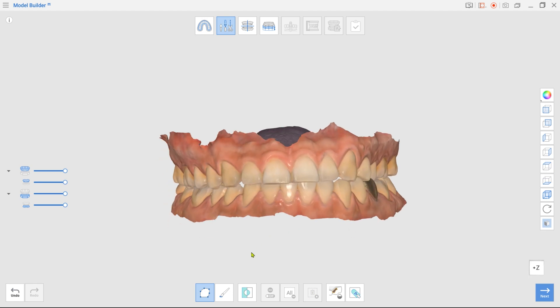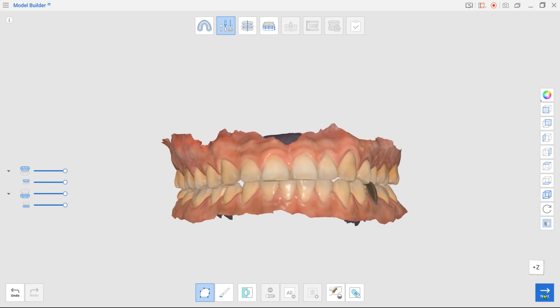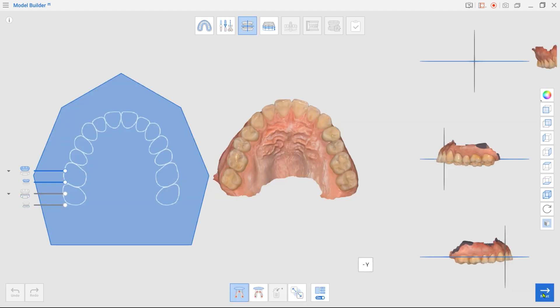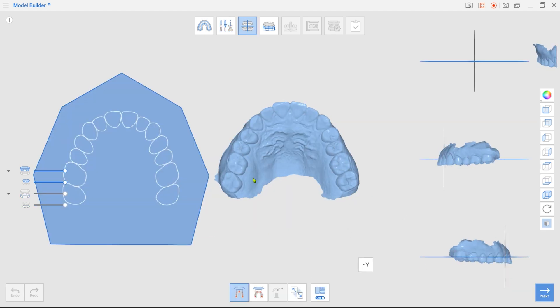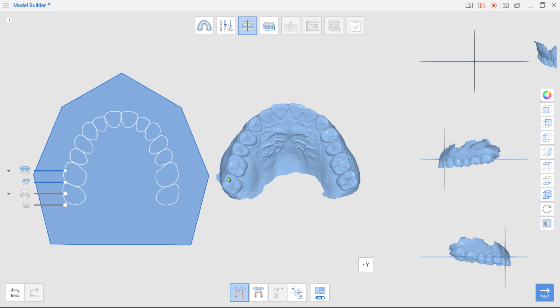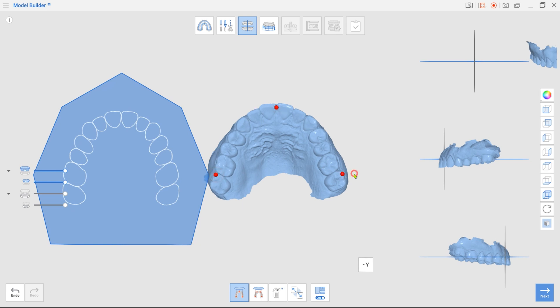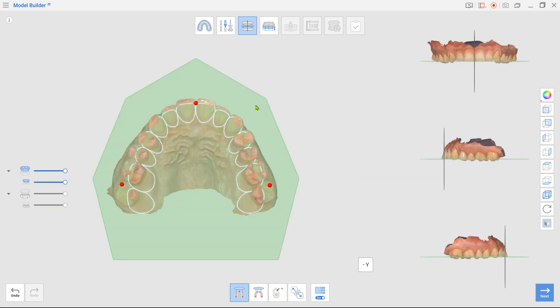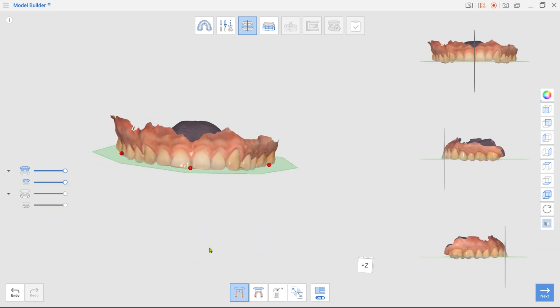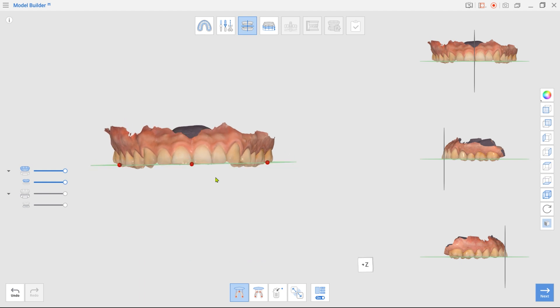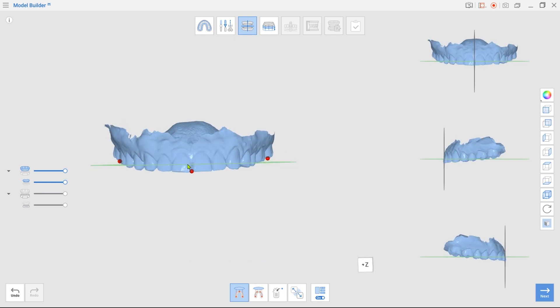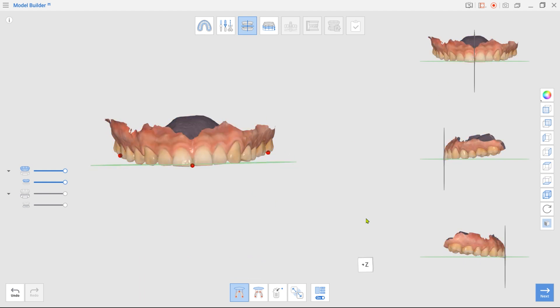Once done, move to Alignment mode. Select three points on the data as shown in the video to align the data with the virtual occlusal plane. Ensure the data is properly positioned by reviewing it from all angles in multi-view.